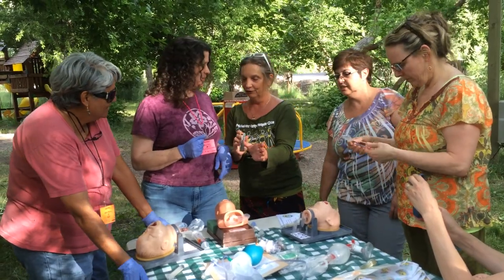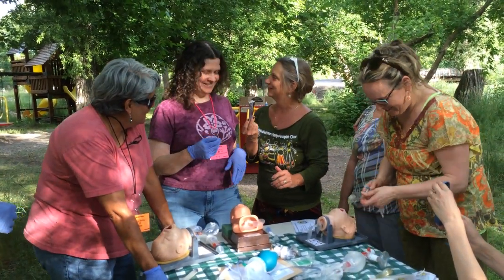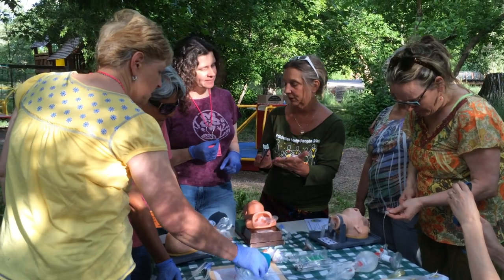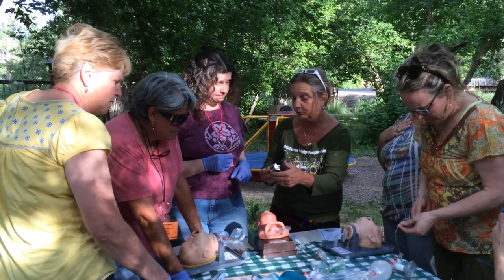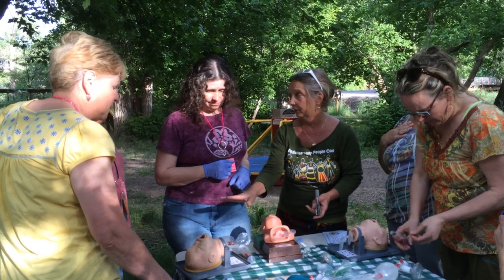How to do it wrong. Okay. So the first thing you do. I don't have muscle memory of doing this wrong. You're never going to do a laryngoscope. I hope not. So the problem with laryngoscopes is you have to have a lot of equipment and it's expensive. You always have to have 2 sets of batteries. You always have to have 2 $45 lamps, because if your lamp doesn't work when you light it up, you're out of luck. No lamps needed with LMA.